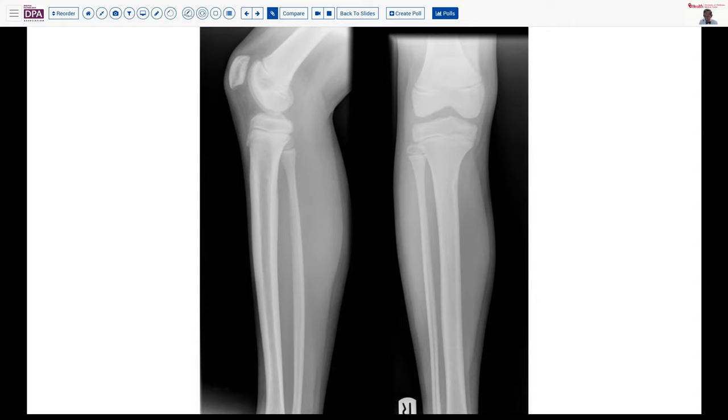So the question here, do we use SATB2 for osteogenic sarcomas? I do not routinely use that. There are some circumstances where we're beginning to use more immunohistochemistry. To this point, I would not say that I rely heavily on it; I still rely on the histology to differentiate those sorts of things.